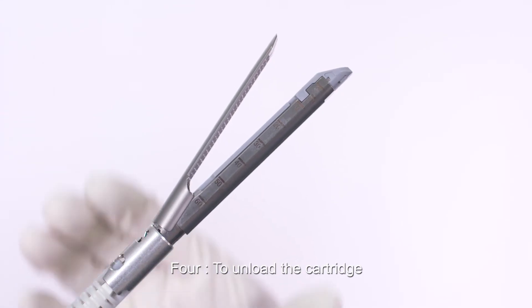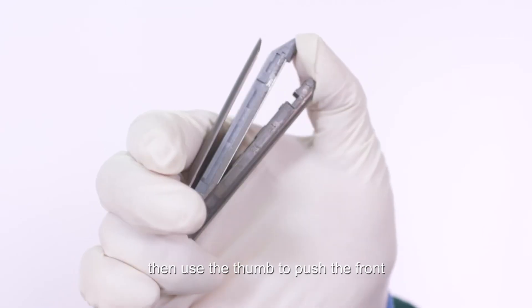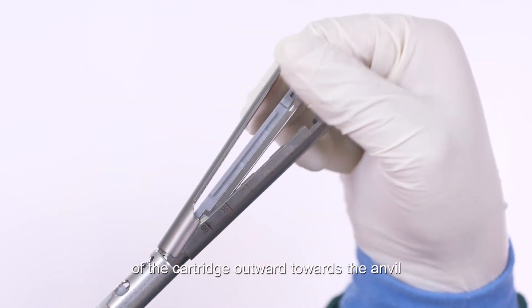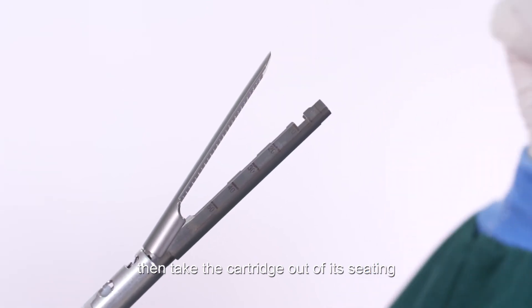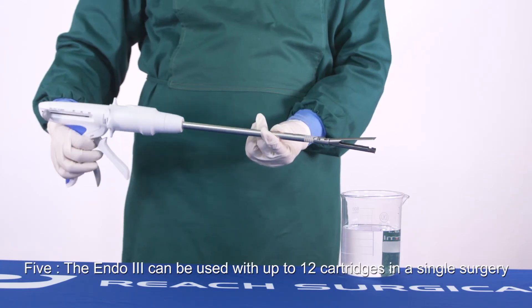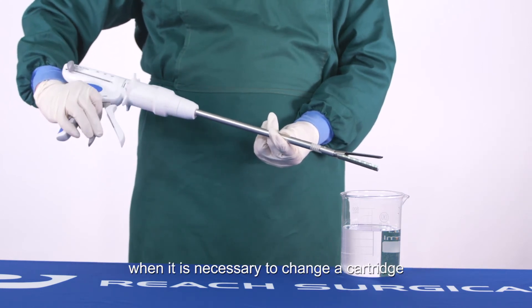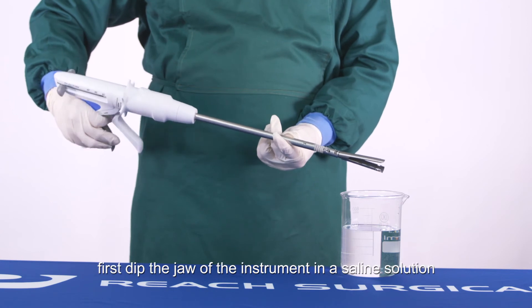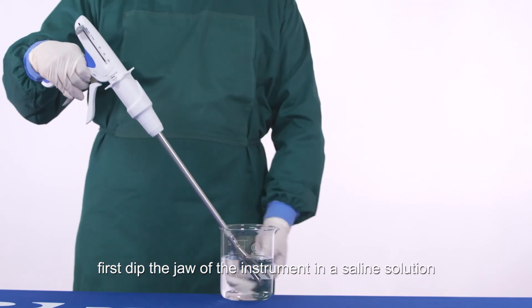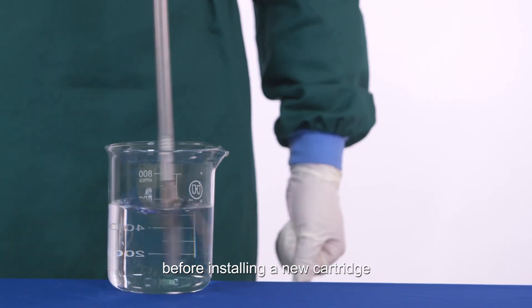To unload the cartridge, grab the base of the cartridge holder, then use the thumb to push the front of the cartridge outward towards the anvil, then take the cartridge out of its seating. The Endo 3 can be used with up to 12 cartridges in a single surgery. When changing a cartridge, dip the jaw in saline solution and rinse to clean any residual staples before installing a new cartridge.